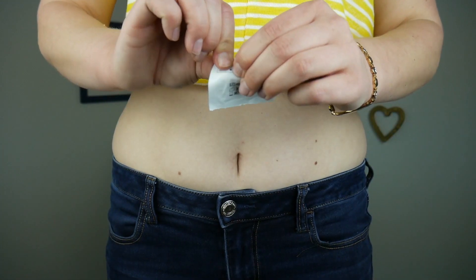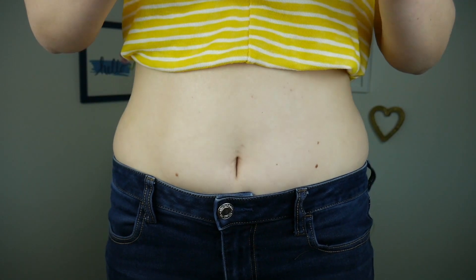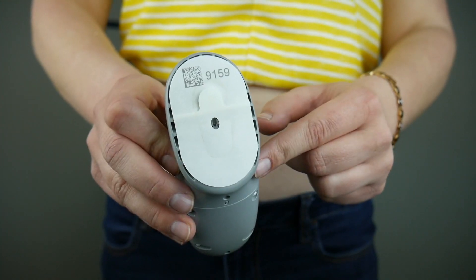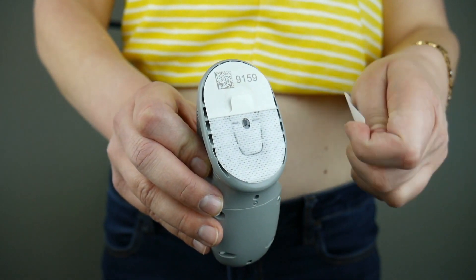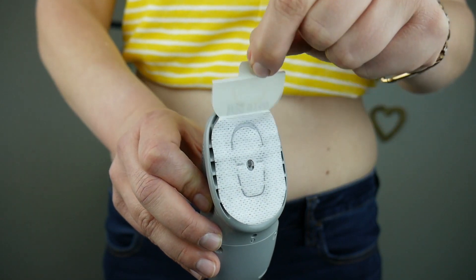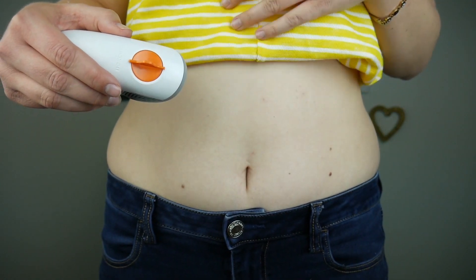First you just want to clean the site with alcohol and let that dry. Then just remove the adhesive backing — there are two easy pull tabs. Now I'm just going to stick the adhesive to where I want to insert it.